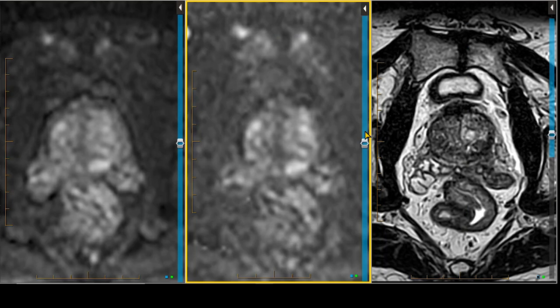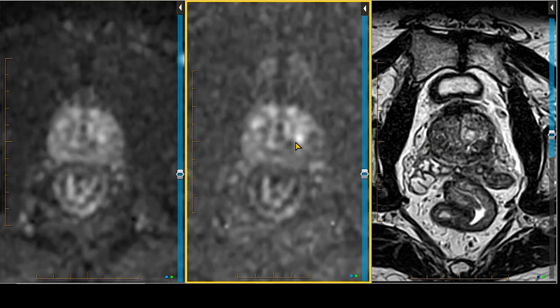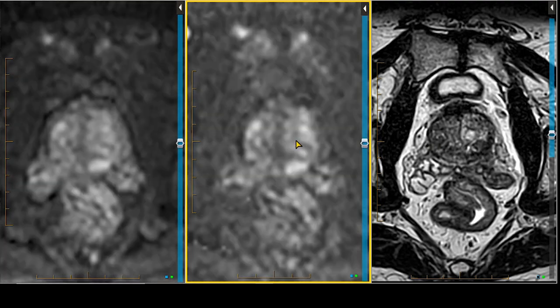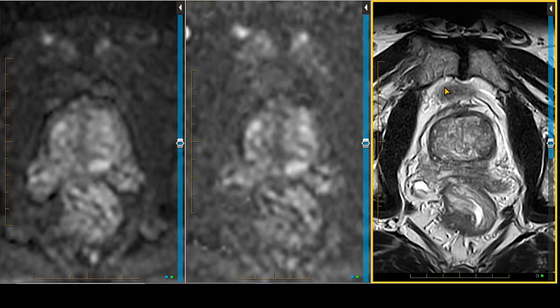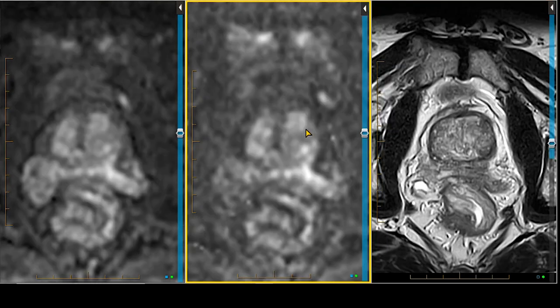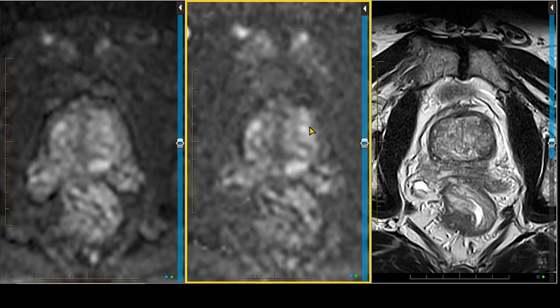So we have a couple of diffusion images and on the right a T2. As we scroll, you may note that the image on the right is not scrolling — and there's a reason for that. It's a 3D acquisition with a one millimeter slice thickness, thinner than the diffusion images. However, we also acquired a 2D slice to match perfectly with the diffusion, using the same slice thickness. Now let's scroll — it scrolls very nicely together.